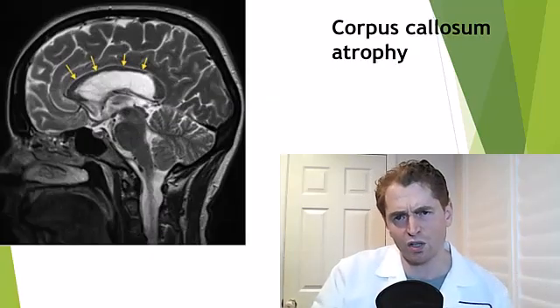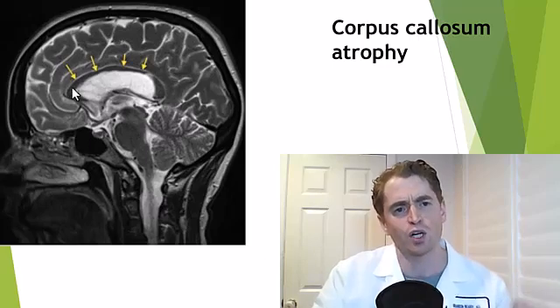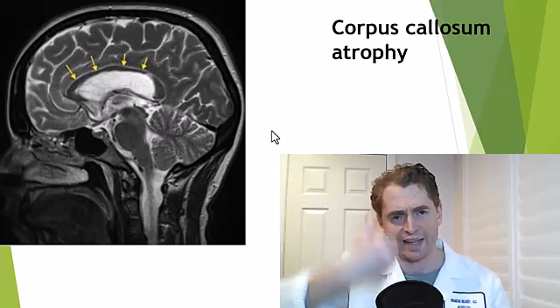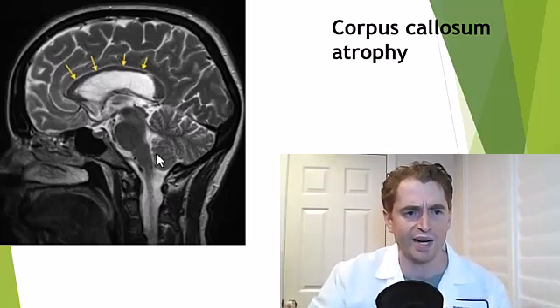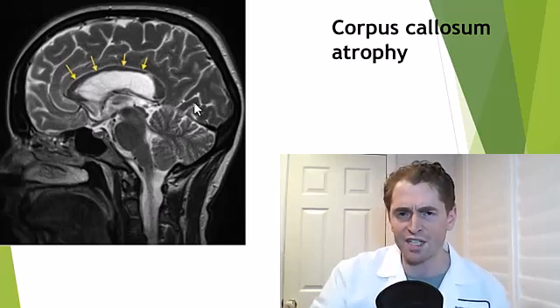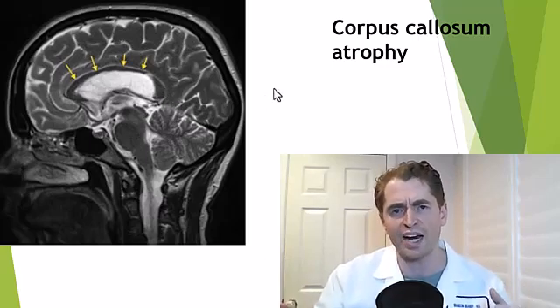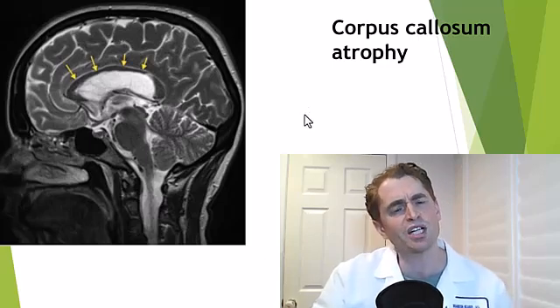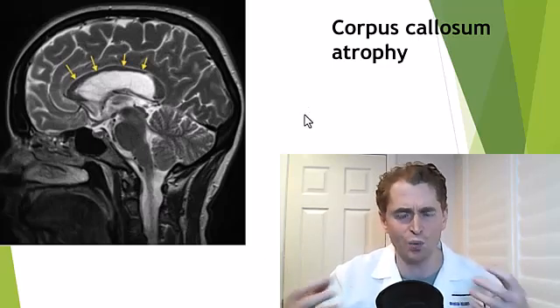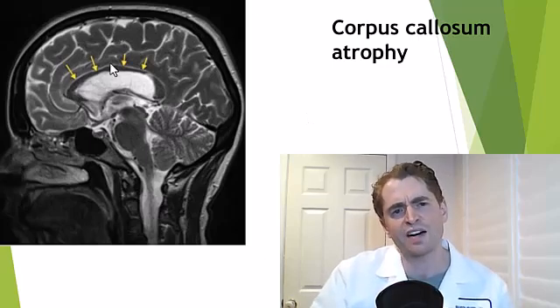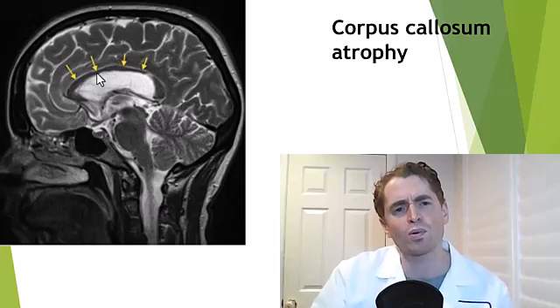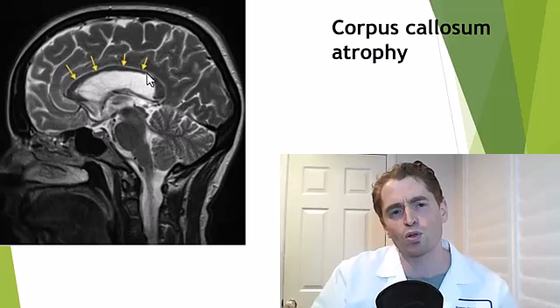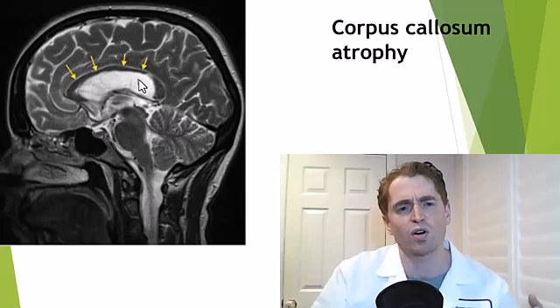Here we have corpus callosum atrophy — shrinkage of this white matter structure. We're looking at sagittal images right through the center of the brain. This is the spinal cord, brain stem, nose, and tongue. The corpus callosum connects the two hemispheres of the brain and is involved in communication between different brain areas. When it's injured, this can be associated with cognitive symptoms, especially processing speed — difficulty doing things quickly and multitasking. This is a very impressive example; normally the corpus callosum is much, much thicker. You can also see a multiple sclerosis plaque, some generalized atrophy, enlarged sulci, and an enlarged lateral ventricle.